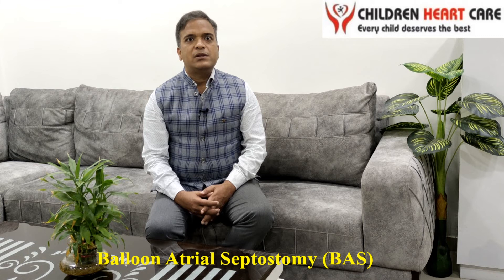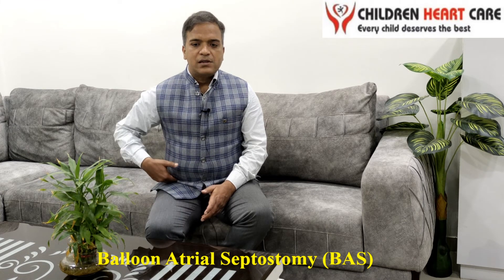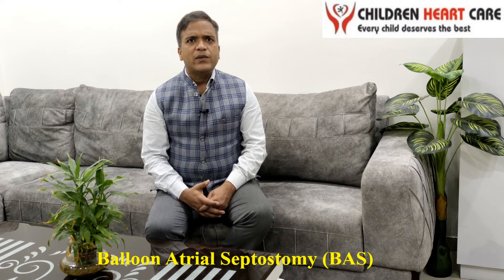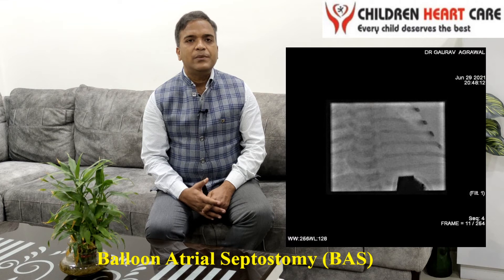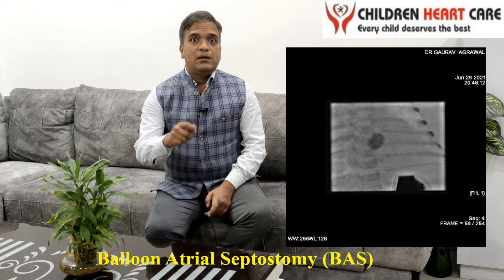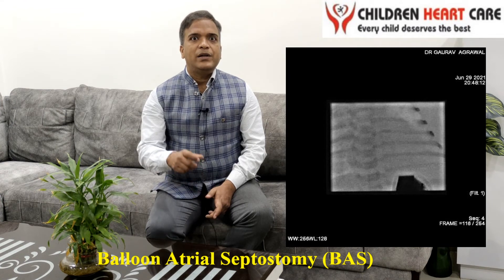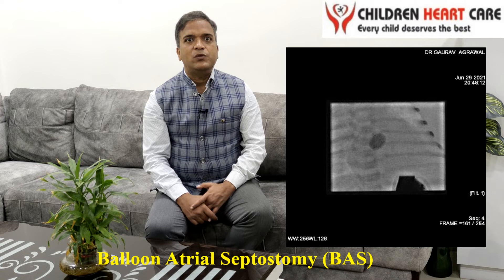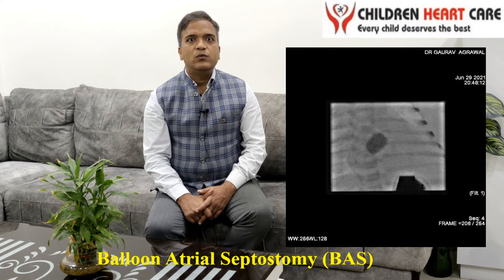So we did a procedure known as the balloon atrial septostomy, in which we took access from the vessels in the thigh and entered into the heart. We placed a balloon, as shown in this running video clip, across the hole, and with a brisk movement of the hand, we increased the size of this PFO from 2 mm to 5 to 6 mm by doing this balloon procedure.